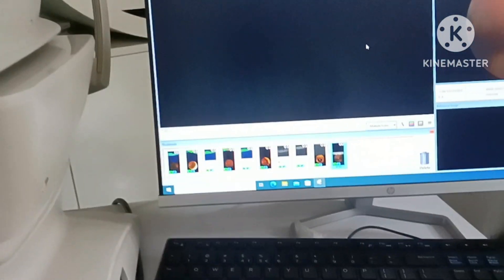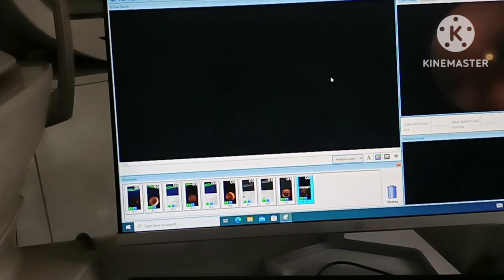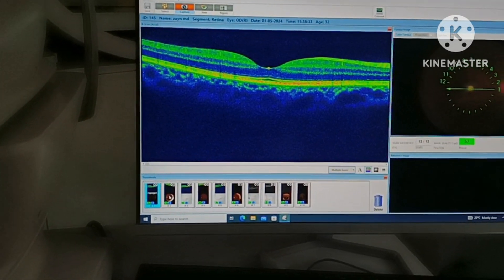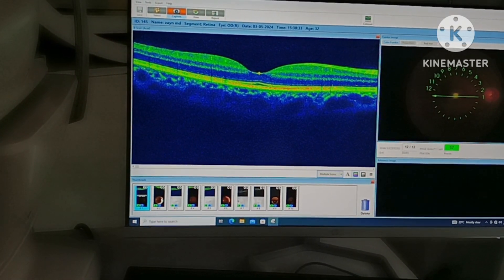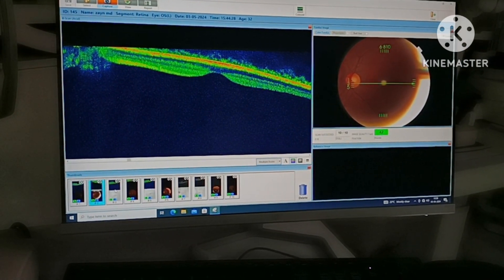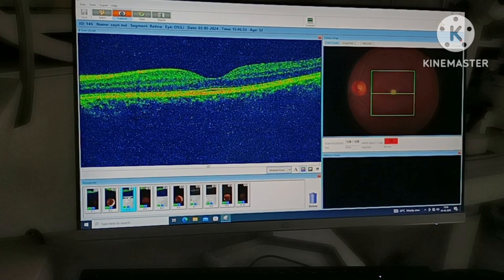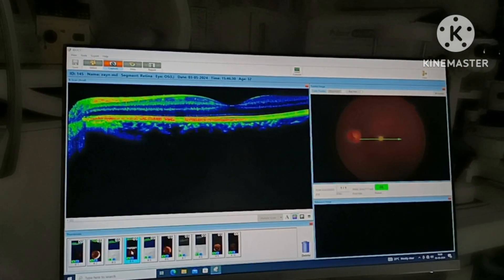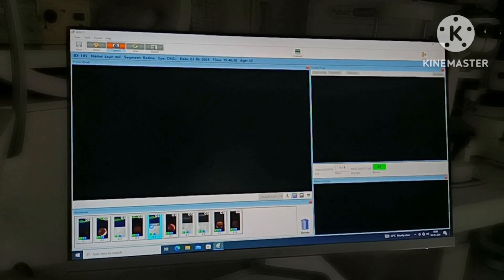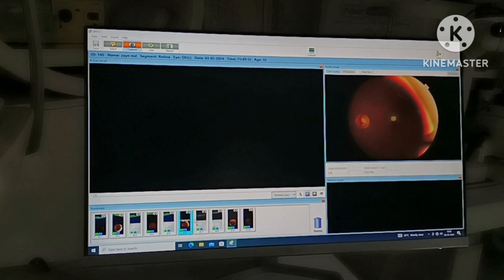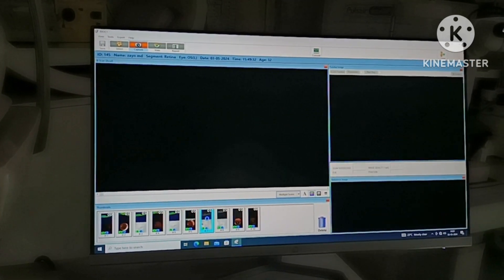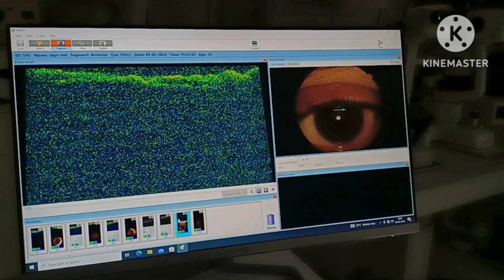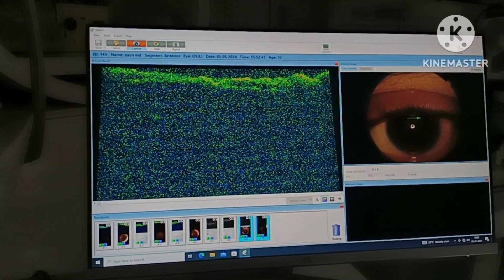So I have taken all photos. First: macular radial. Second: five line cross. Third: 3D macula. Fourth: line. Then 3D disc, fundus, 3D wide, and 3D macula. Also line anterior segment and peripheral photo.